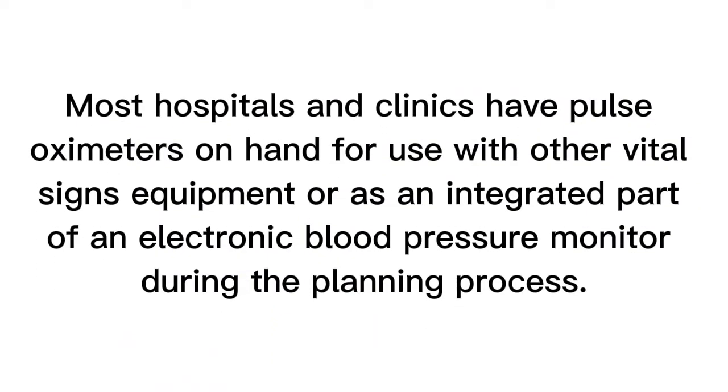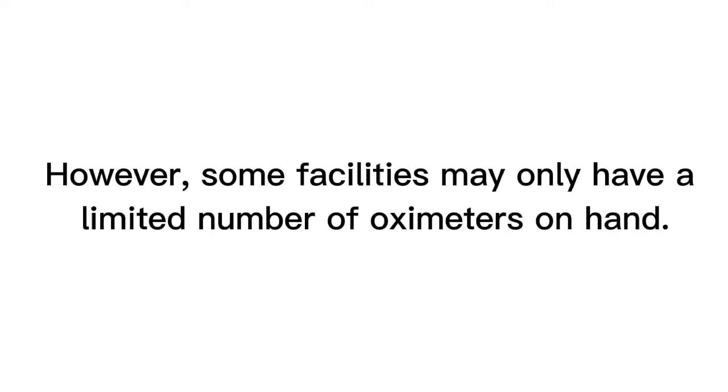Next, for our planning, most hospitals and clinics have pulse oximeters on hand for use with other vital signs equipment, or sometimes as an integral part of an electronic blood pressure monitor during the planning process. However, some facilities may only have a limited number of oximeters on hand.